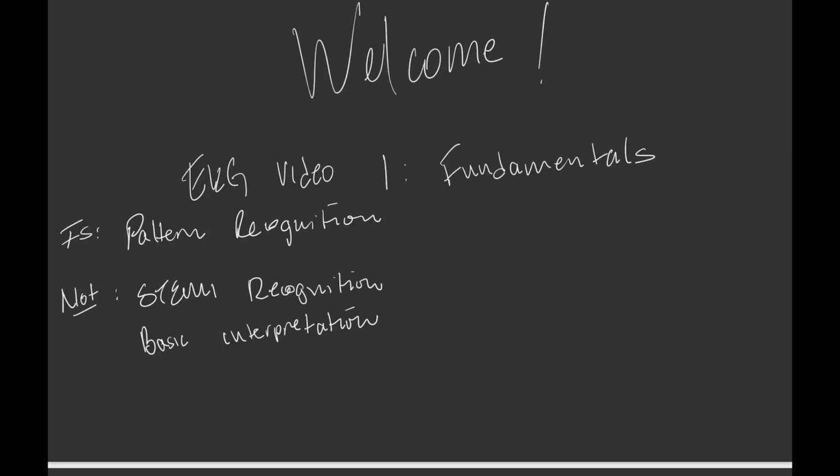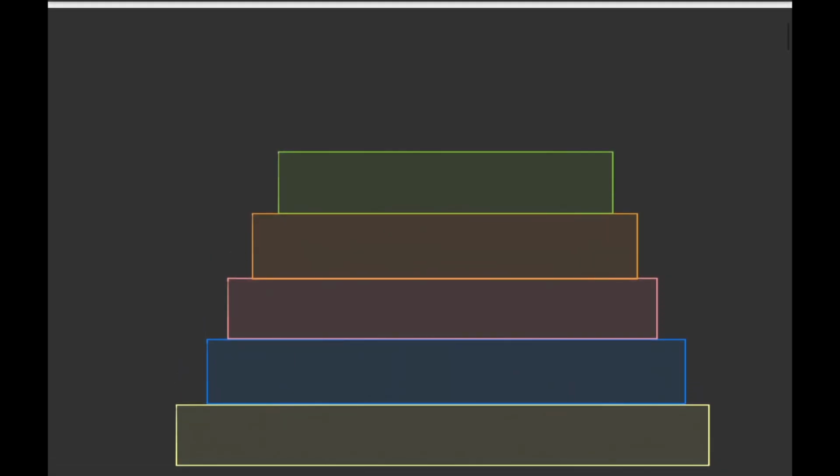Right? And real quick, the motivation for making this video is that I think that people struggle with 12 leads, not necessarily because they can't do it, but because the education of 12 leads seems to be a little flawed. So I've come up with this EKG pyramid that I think helps recognize the steps that someone goes through when trying to understand 12 lead and get more comfortable with 12 lead recognition.